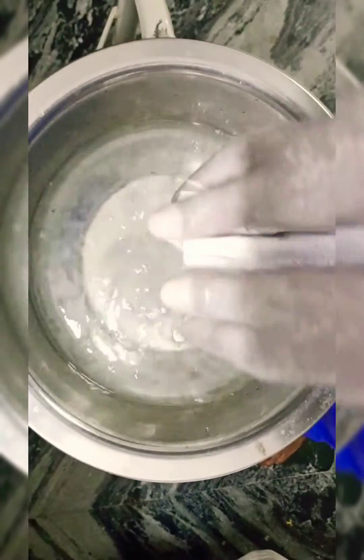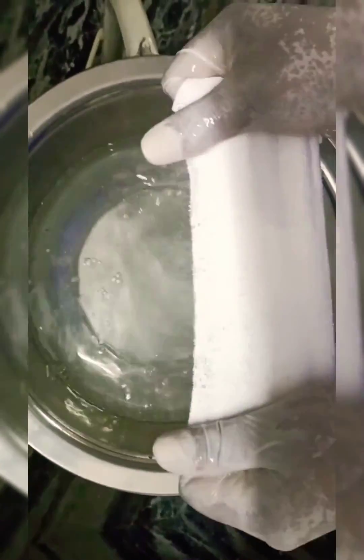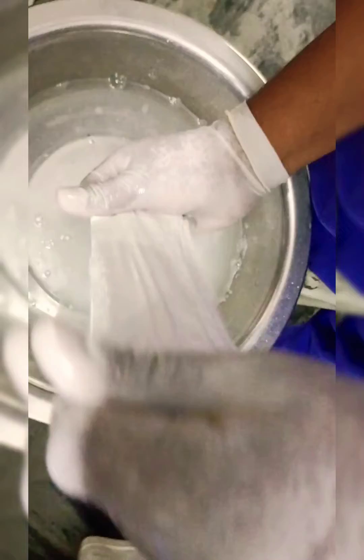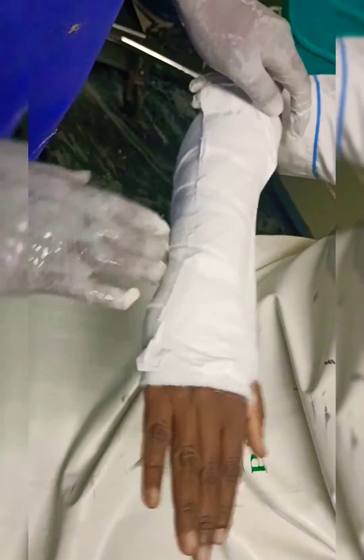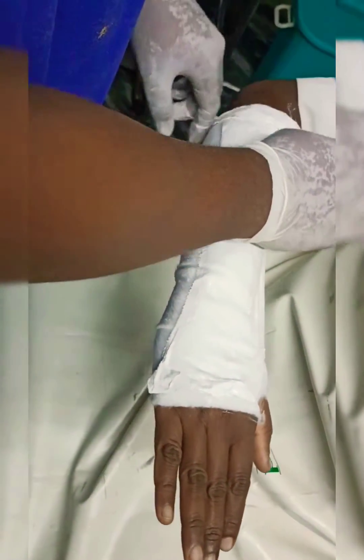Hold the POP slab in position and immerse it in water for 5 seconds. Take it out of water and gently squeeze out the excess water. Place the wetted POP on the forearm as explained in the video.